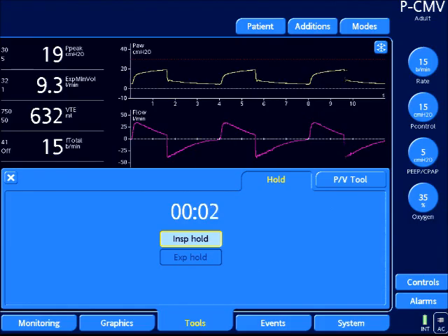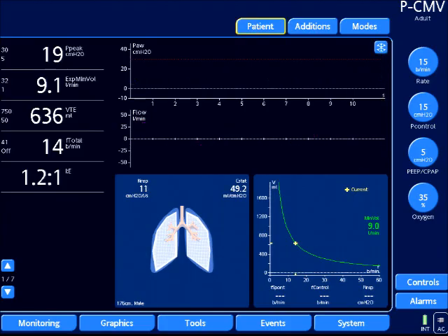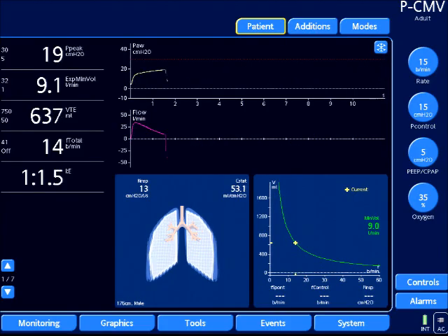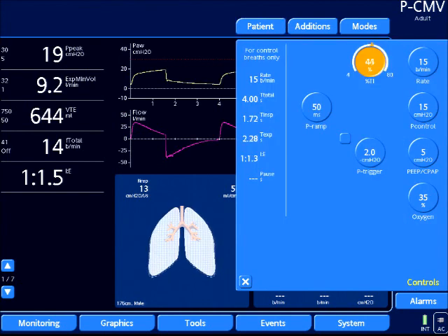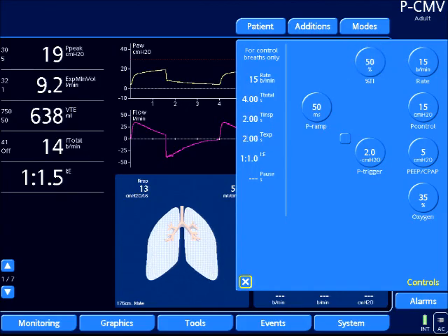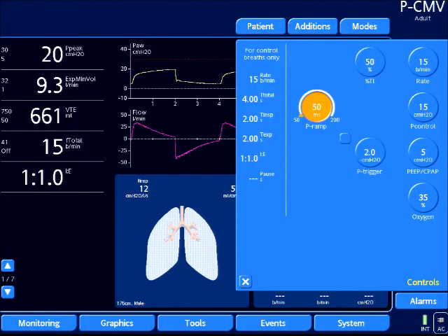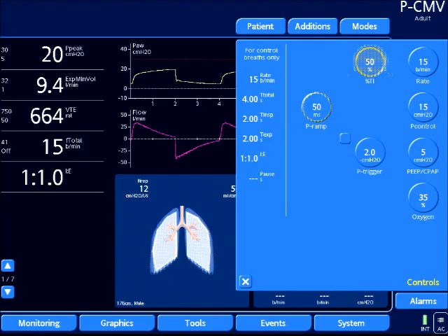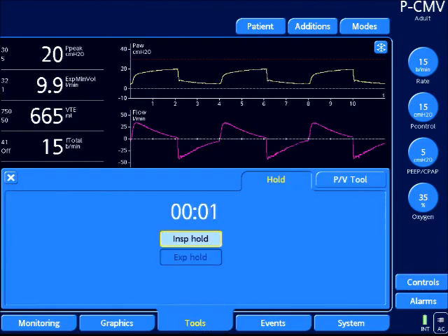I'm going to select tools, inspiratory hold — it's going to freeze the screen. I'm going to scroll over, and it's almost 19; it's 18, still a little under. I'm going to increase my inspiratory time one more time so my inspiratory flow is fully decelerating to baseline. Now my plateau and peak pressure should be equal. It looks like based on the waveform I'm fully decelerating now, so my peak and plateau should be equal.